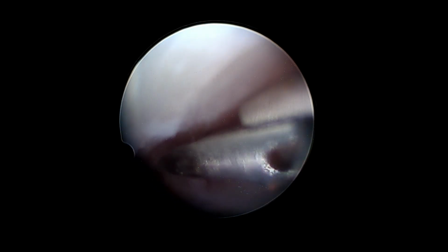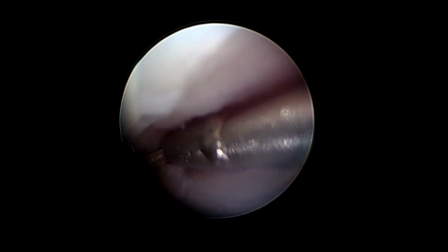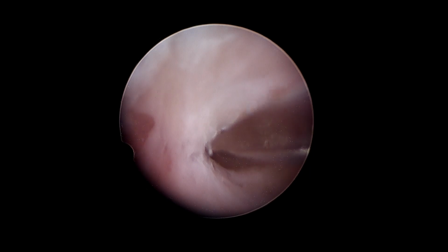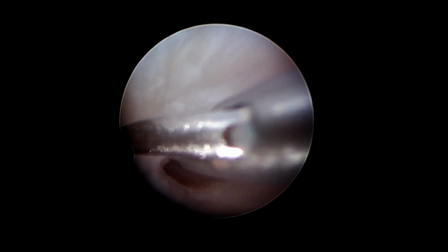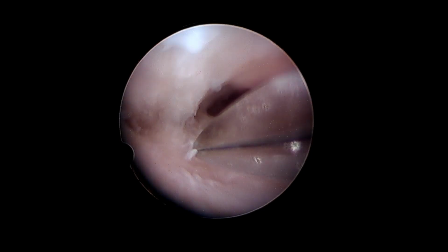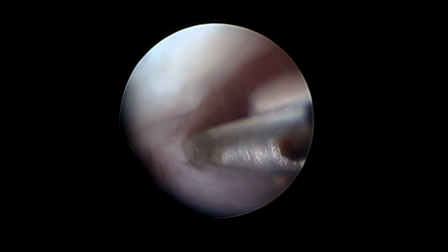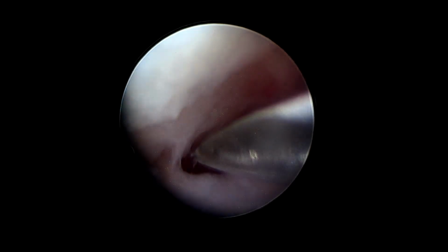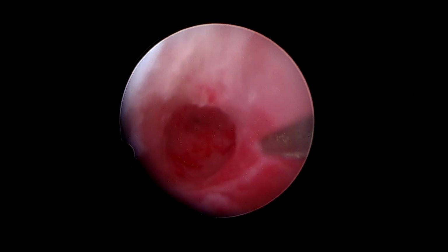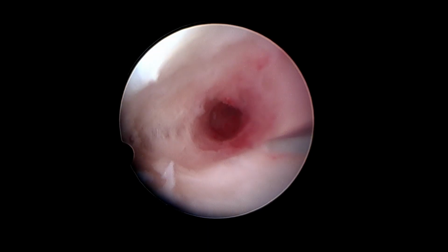You don't cut the fibers directly in front. You go sidewise towards the uterine cavity, come back, and then do the adhesiolysis of the remaining portion of the scar. You can notice here we have gone inside, cut, and then came back and again started adhesiolysis right from the cervix towards the uterine cavity. This way you avoid injuring more and more endometrium, and if you can preserve the maximum amount of endometrium, the patient can have high chances of fertility.